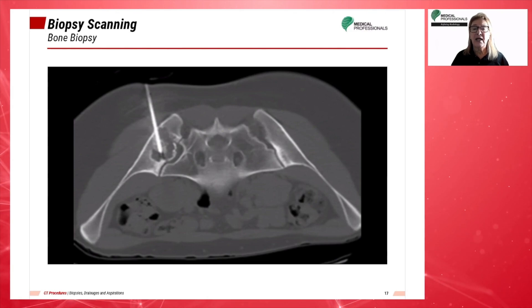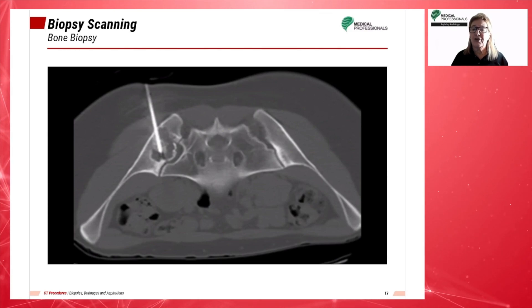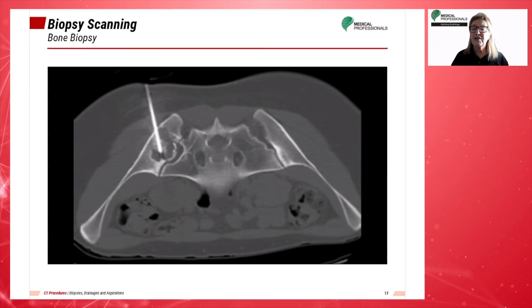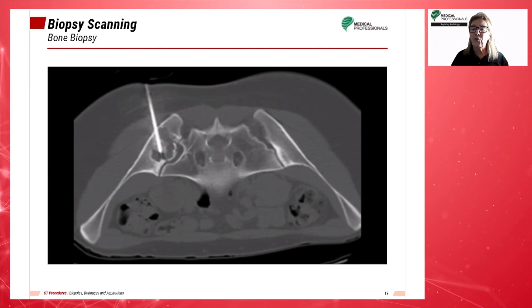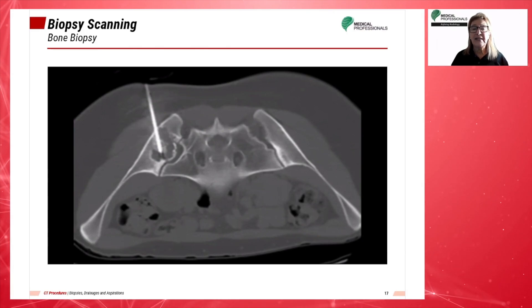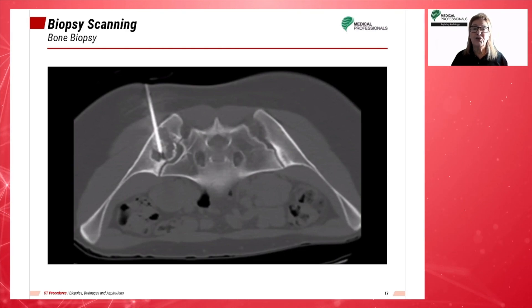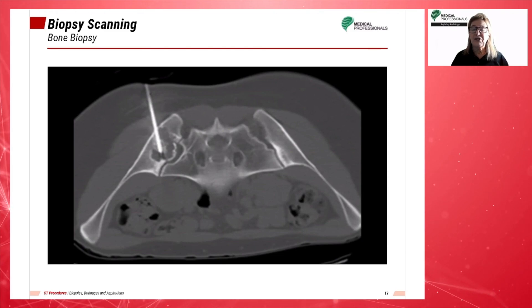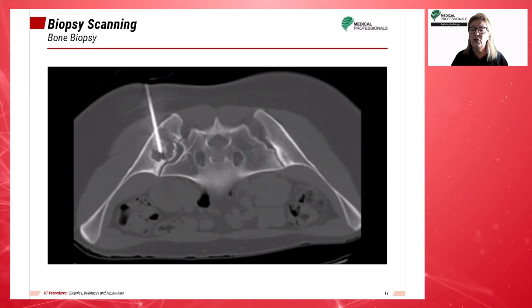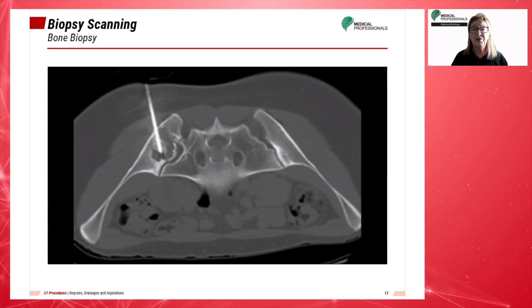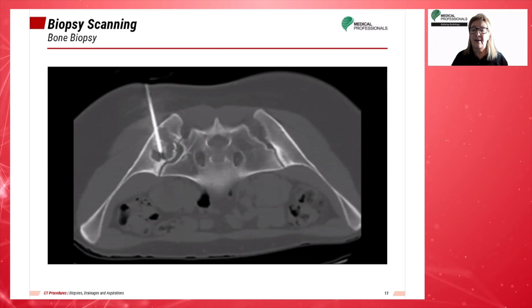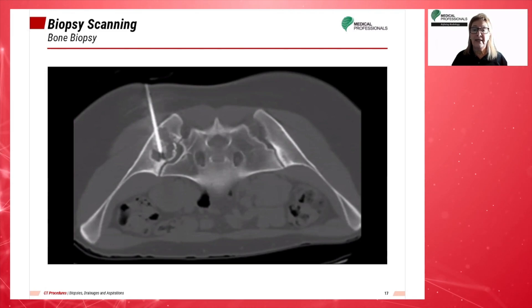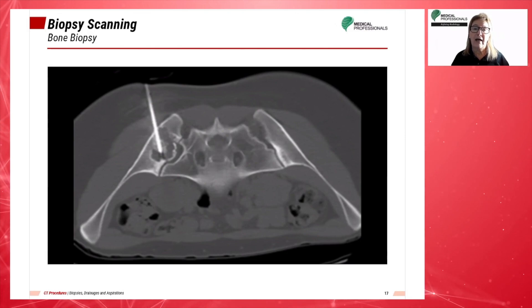This CT-guided left sacral biopsy procedure and possible complications were explained to the patient and informed consent was obtained. CT guidance was used for the biopsy using a sterile technique. A local anesthetic along with IV fentanyl was administered to the patient. Three bone biopsies of the left sacral ala were performed with two specimens successfully obtained. The patient suffered no immediate complications and recovered in the radiology department.